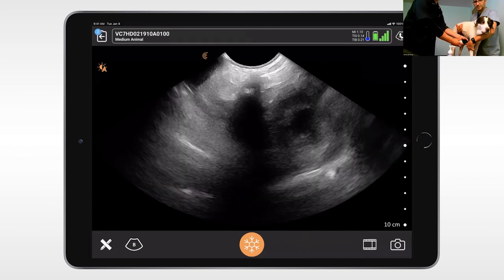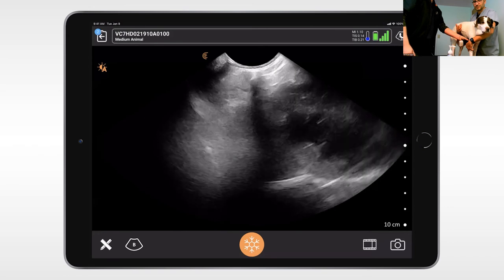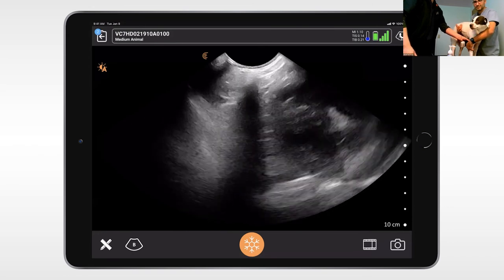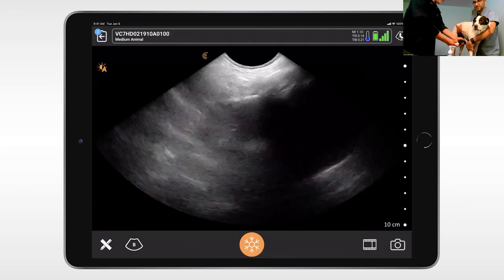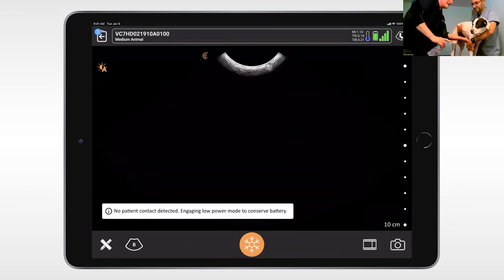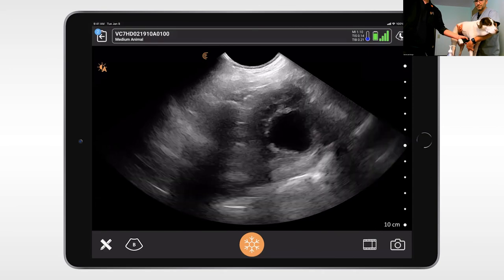And at that spot, if I really wanted to, I can turn the probe parallel to the ribs, and then I get that four chamber view where the left ventricle is in the far field and the right ventricle in the near field. I can also pick up that left atrium as well. So again, a really nice window for us. And again, we're not cardiologists, so we're not looking for perfect measurements. You have a patient in a standing position, which would normally be a tougher position to scan in. But we're just worried about the things we want to answer in emergency.